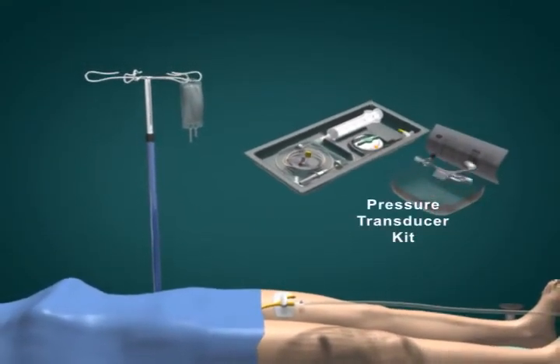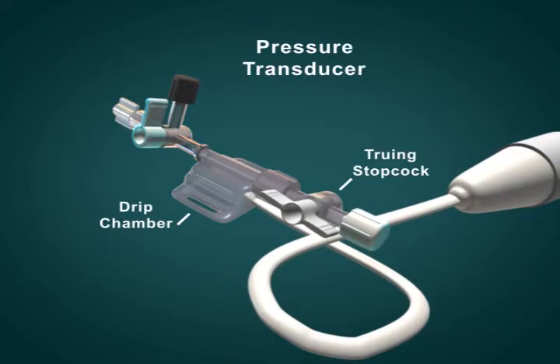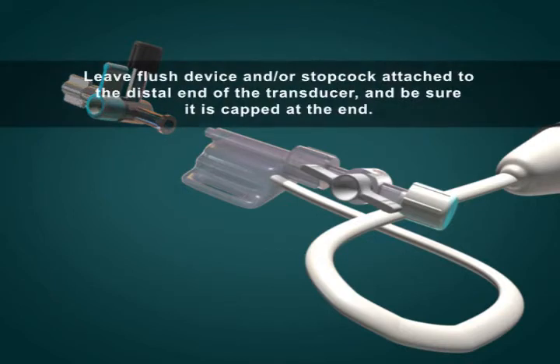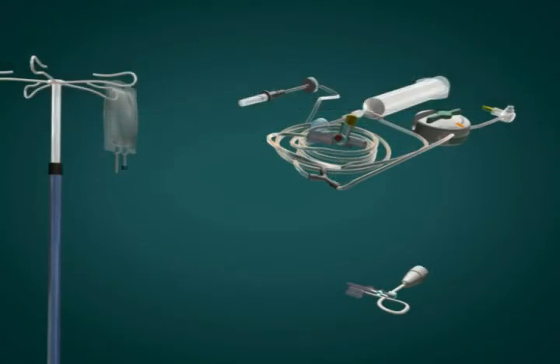Open a pressure transducer kit (not included) in sterile fashion. Note: the Bard intra-abdominal pressure monitoring device adapts to the pressure transducer used in your ICU. Many pressure transducer variations exist, all of which are compatible with the Bard intra-abdominal pressure monitoring device. Although a flush device is not required, the device can be used with one. Leave the flush device and/or stopcock attached to the distal end of the transducer and be sure it is capped at the end. Grasp the coiled tubing, remove the entire assembly from the tray, and verify all tubing connections are secure.